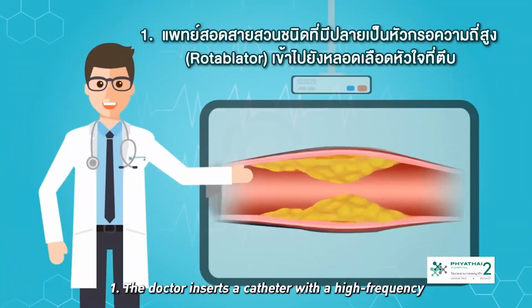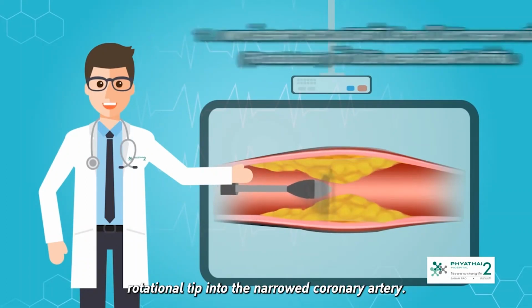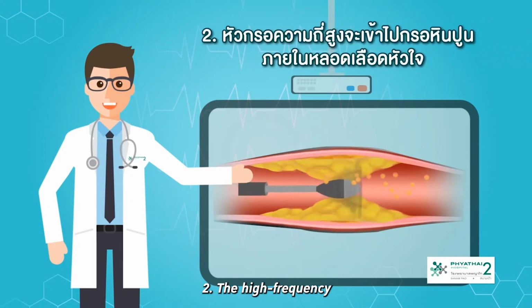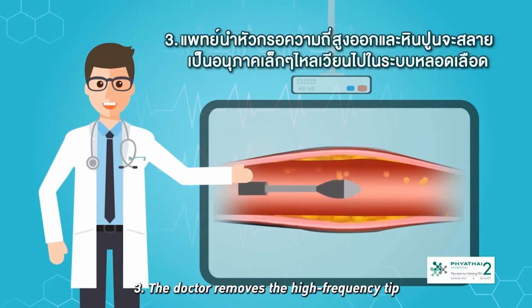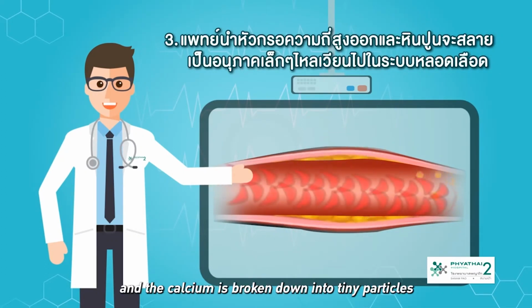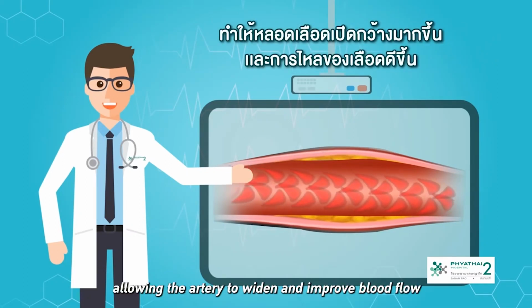1. The doctor inserts a catheter with a high-frequency rotational tip into the narrow coronary artery. 2. The high-frequency tip abrades the calcium inside the coronary artery. 3. The doctor removes the high-frequency tip, and the calcium is broken down into tiny particles, circulating through the bloodstream, allowing the artery to widen and improve blood flow.